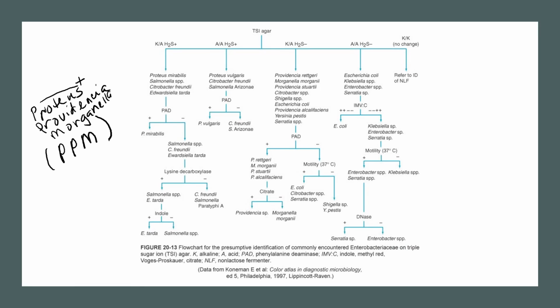Let's look at the flow chart and notice the test PAD and the list of organisms that are PAD positive. Take note of that. But before I continue with the flow chart, I will divert for a little bit. Do you know what PAD stands for?